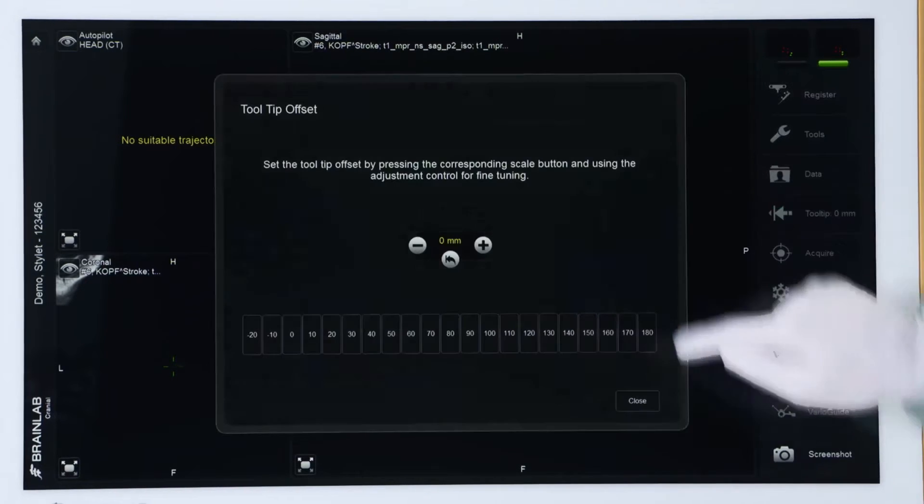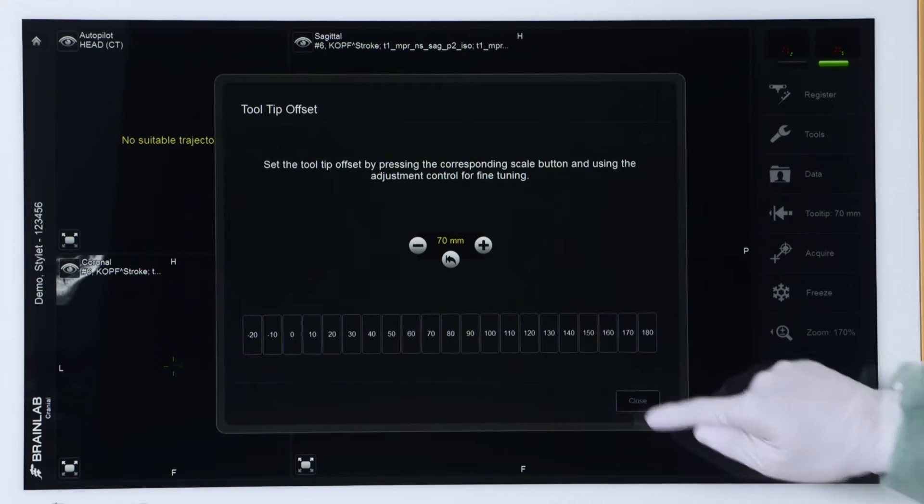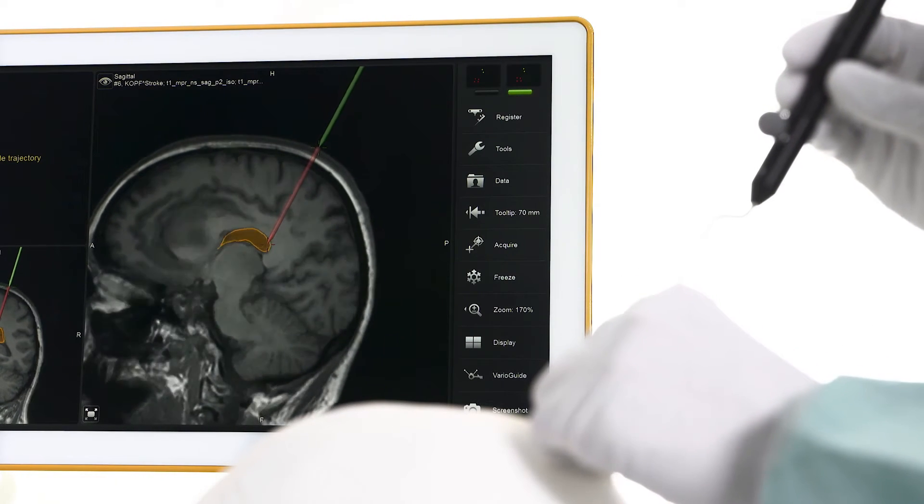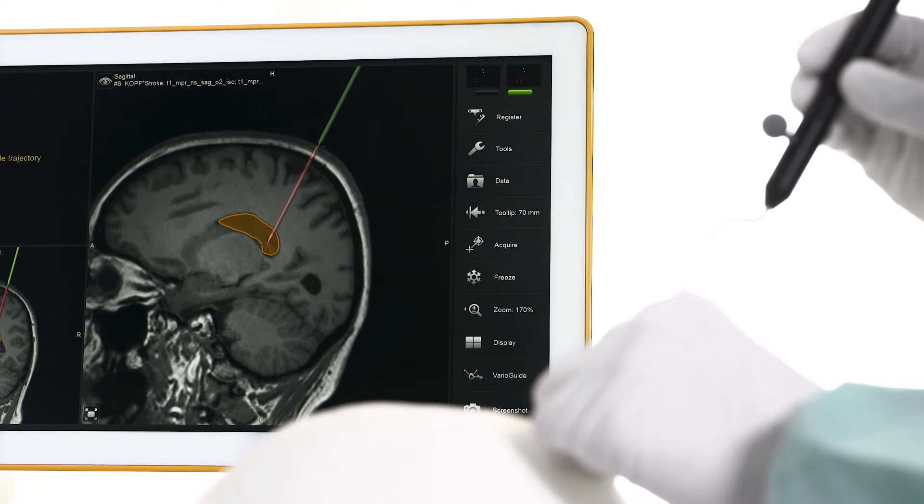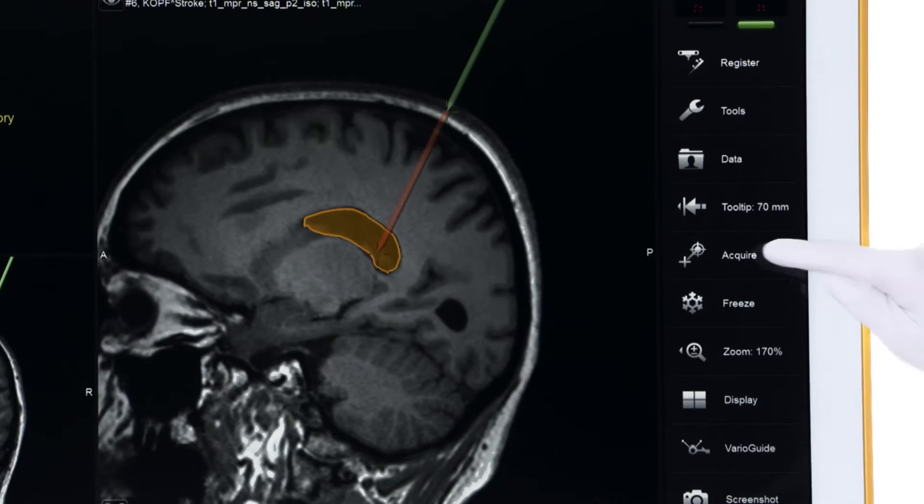With BrainLab navigation, surgeons can plan trajectories for catheter placement, so even complex procedures like shunt placement in slit ventricles can be successfully performed on the first try.